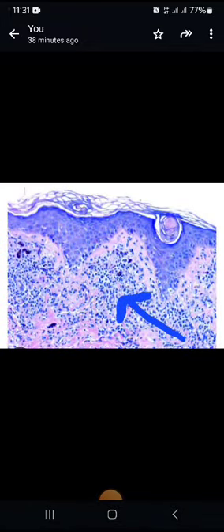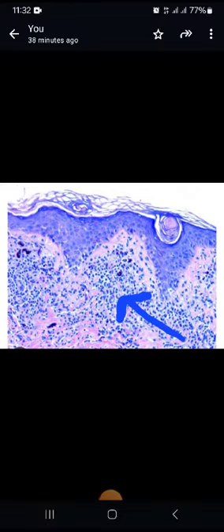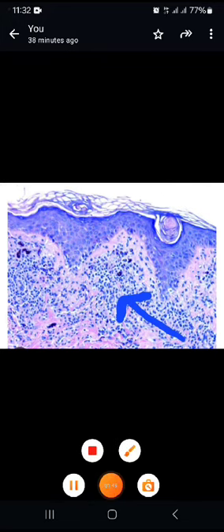One important point to mention is that vacuolar basal degeneration is present in other disorders as well, like erythema multiforme and PLEVA. However, the lichenoid band of infiltrate — that is, the tagging of the dermo-epidermal junction by lymphocytes — is specific for LP and other lichenoid disorders. Thank you.